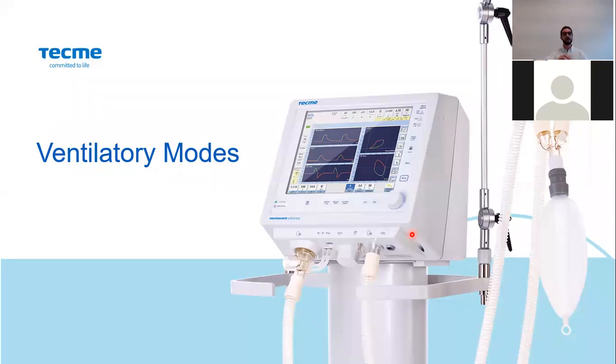Then we have control mode and we have assist mode. So in control mode, the ventilator controls all the phases. The ventilator controls the inspiration, all the phase variables. The ventilator will control the triggering. The ventilator will control the limit variable.